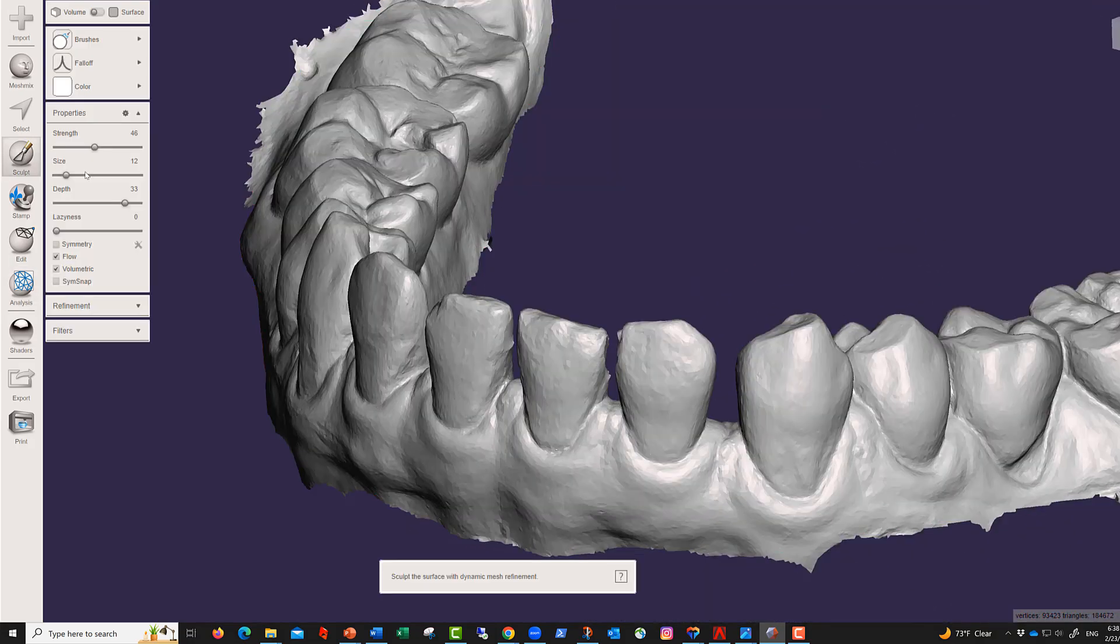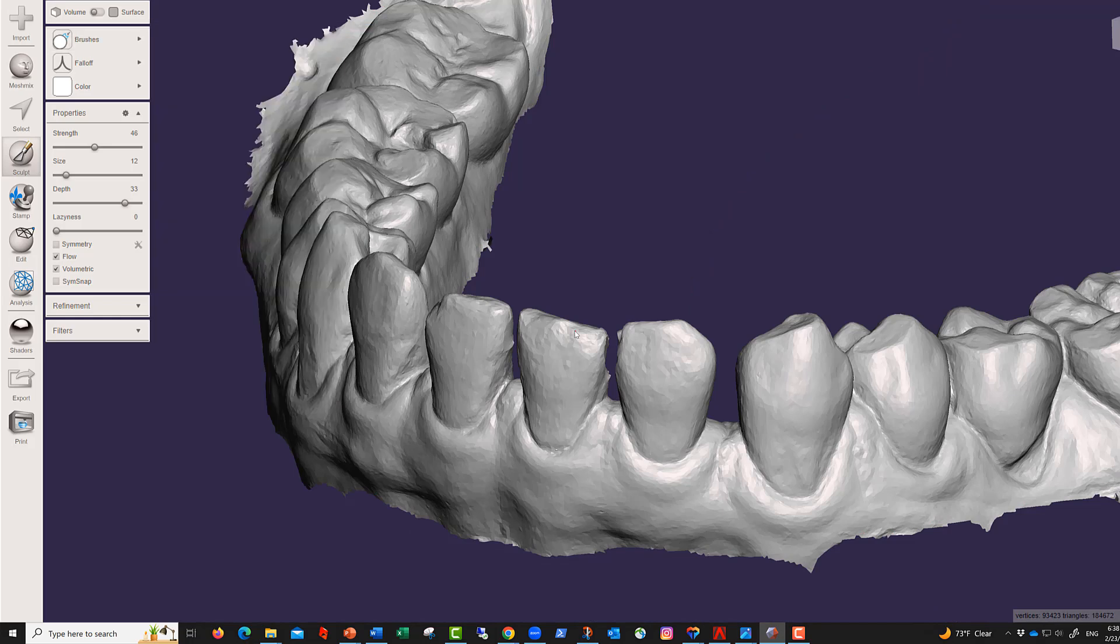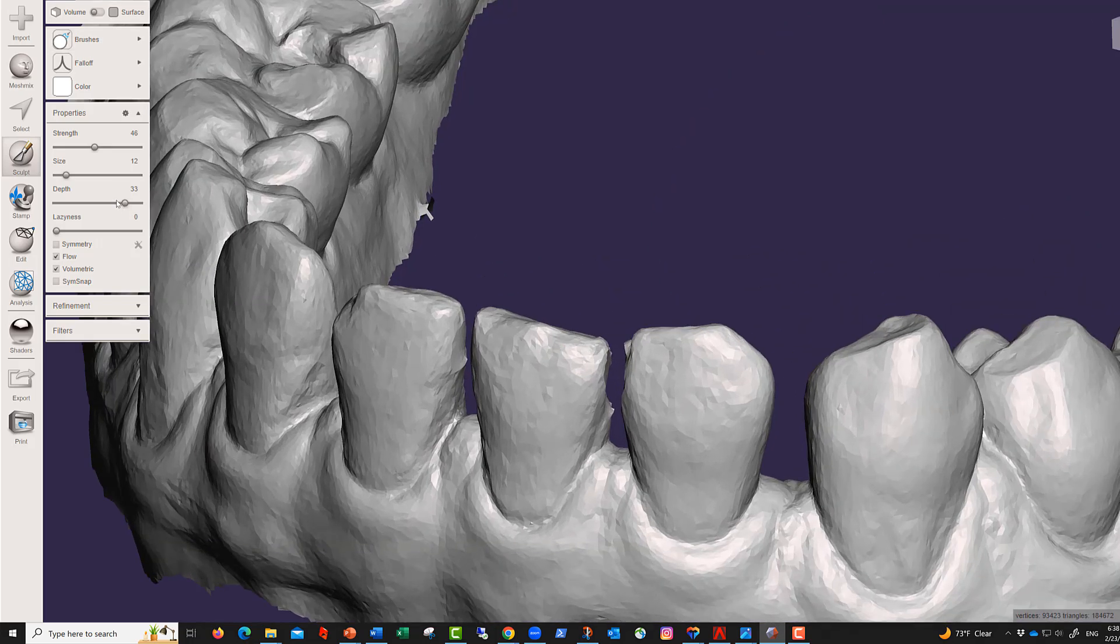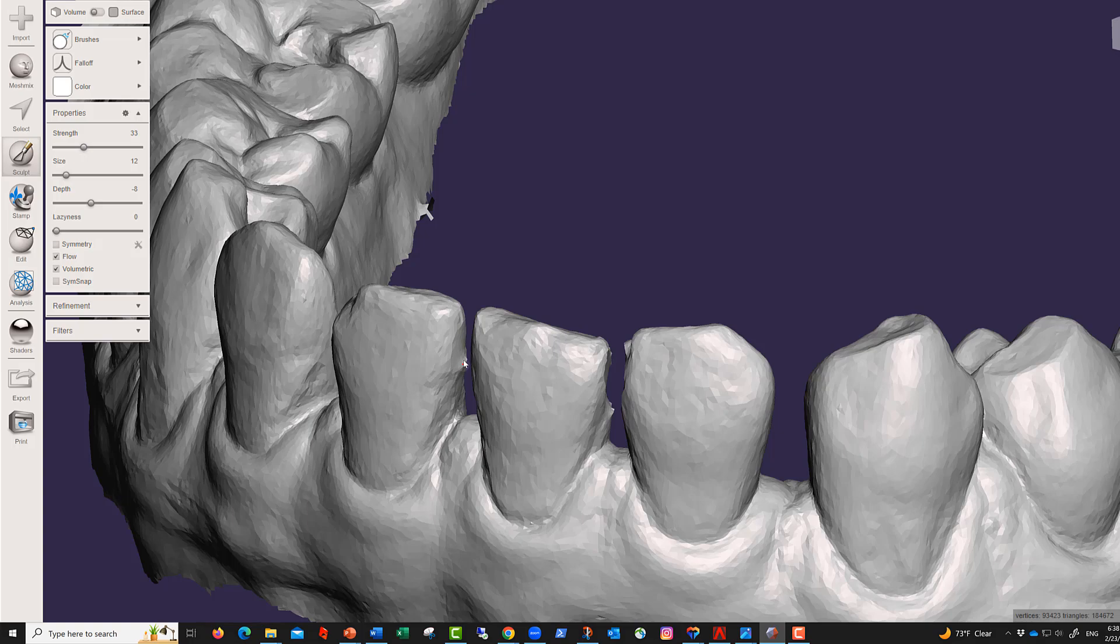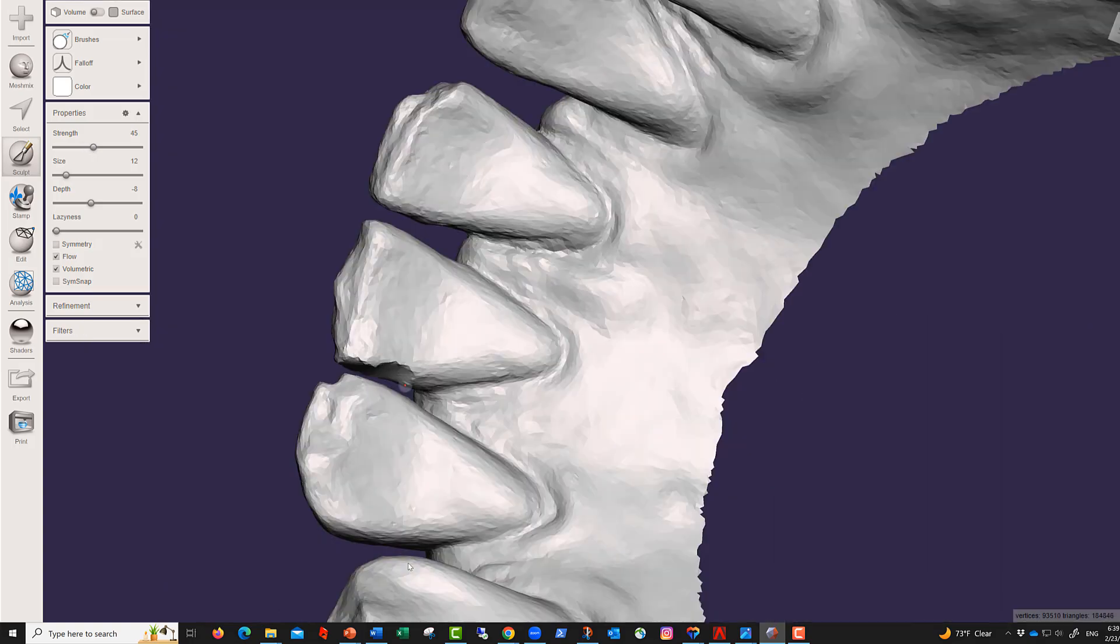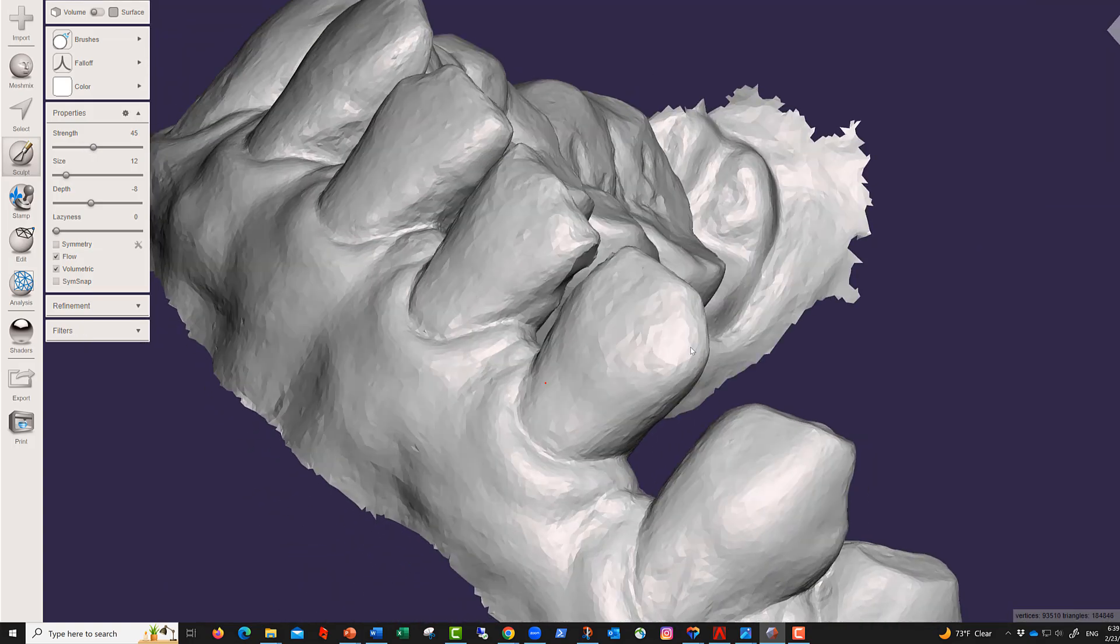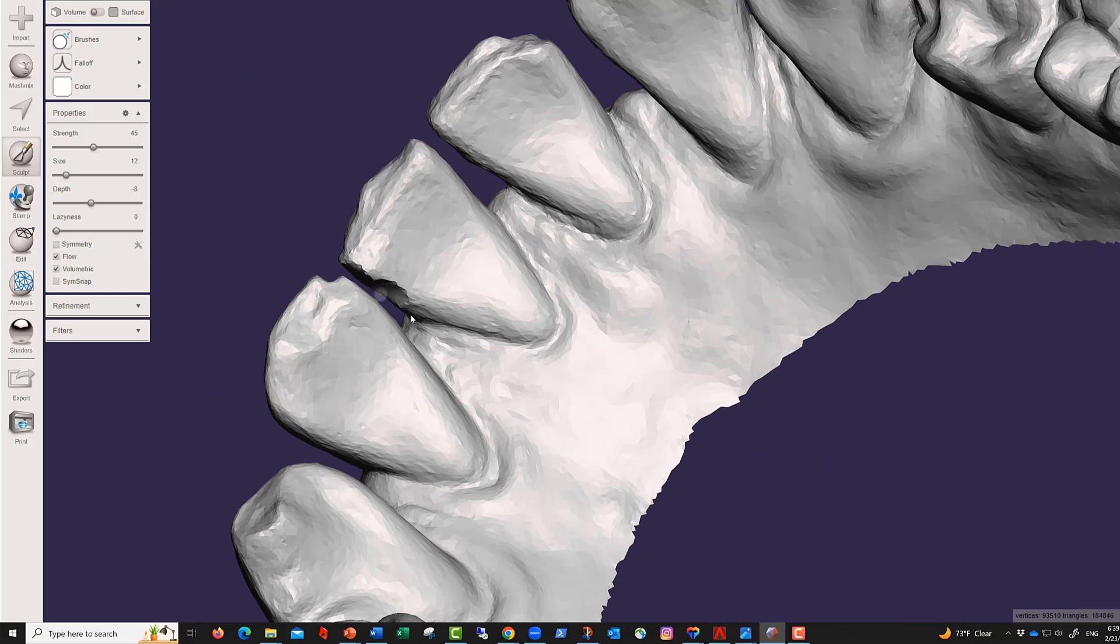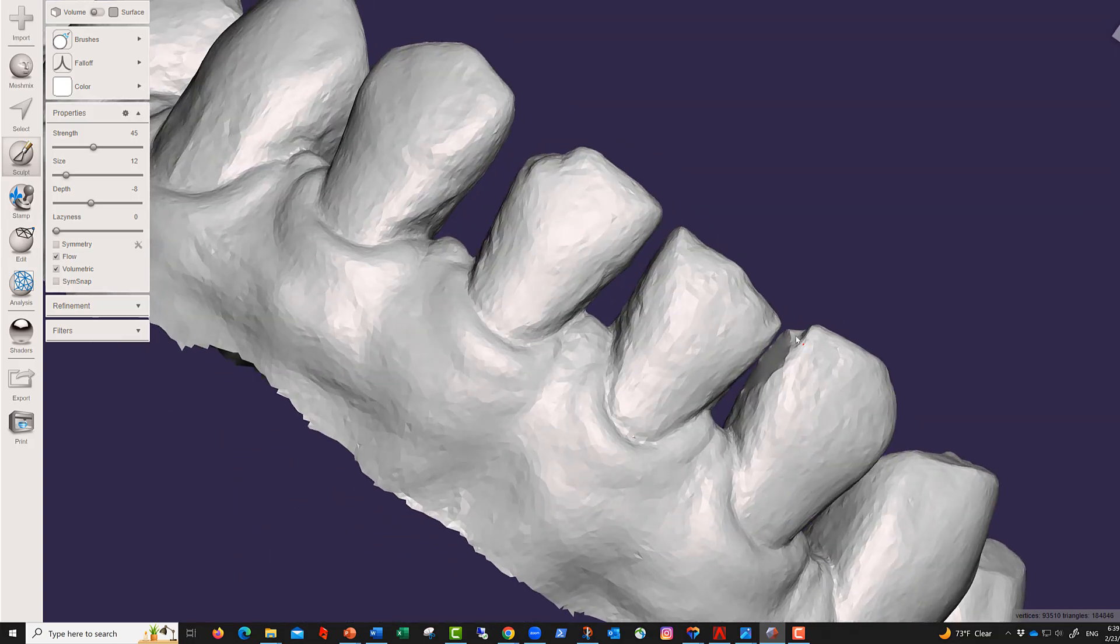You can go to sculpt in brushes, shrink smooth again. The depth is not too big, don't go too hard on the strength, and just smooth. You see, this should probably be a little bit bigger because we may have a problem with this one.